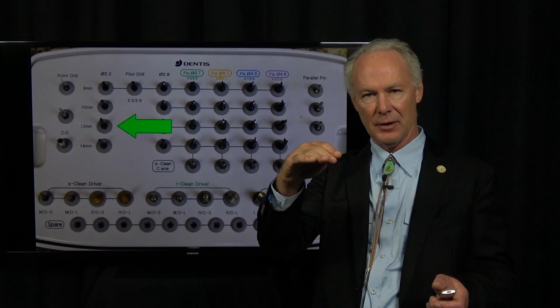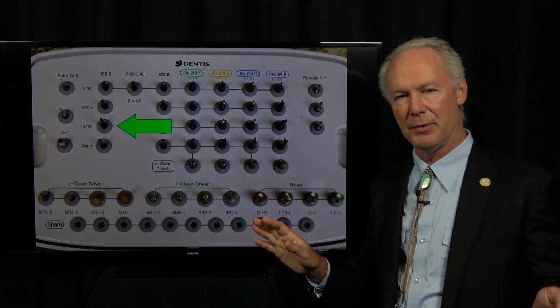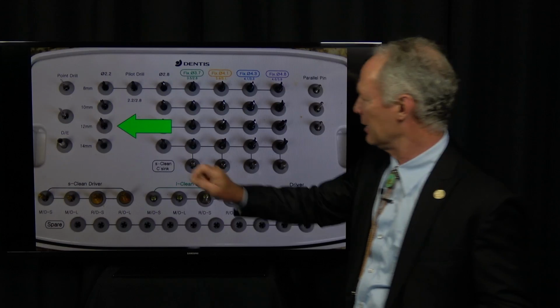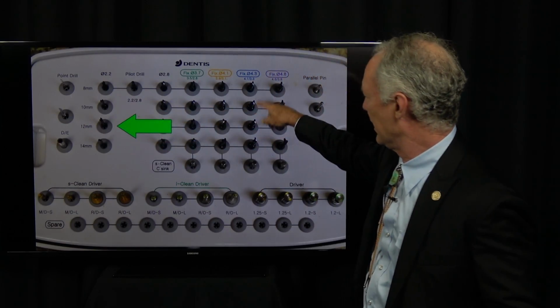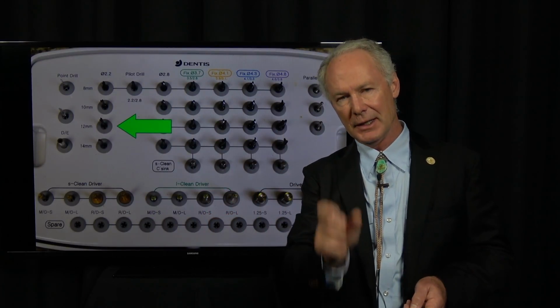I hate those drills that are silver with the black lines on them, because when they're spinning and you've got water and saliva and blood, you can't keep up with the black line and you can't be specific. This is perfectly specific. The only hard part about this is establishing your pre-drill vertical depth, and you do that with the pilot drill with the rubber stoppers. Then once you've established that, just boom, boom, boom. And the width of the drill obviously depends on the width of the alveolar crest. You want at least 1 millimeter of bone, facial and lingual, to your drill or to your implant.